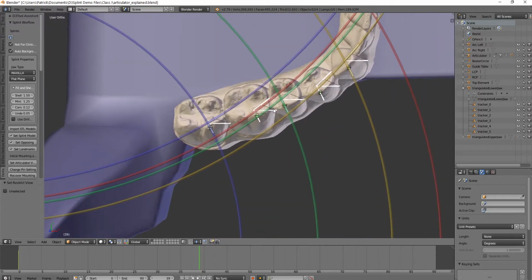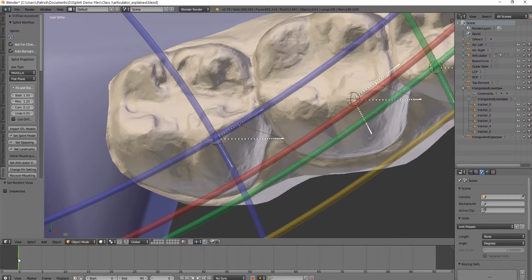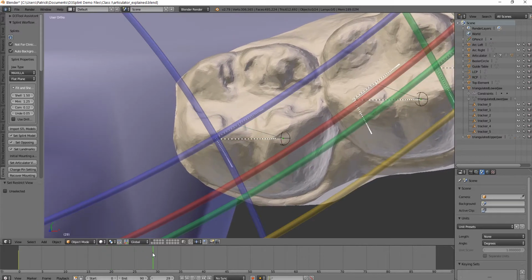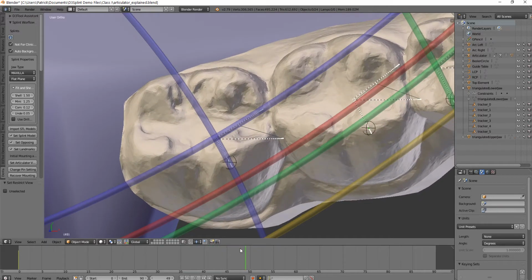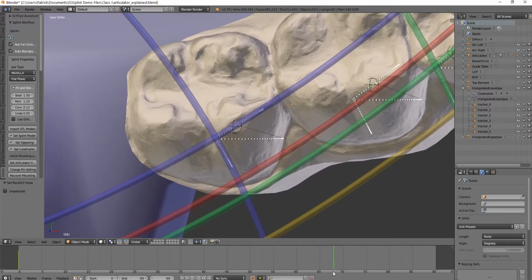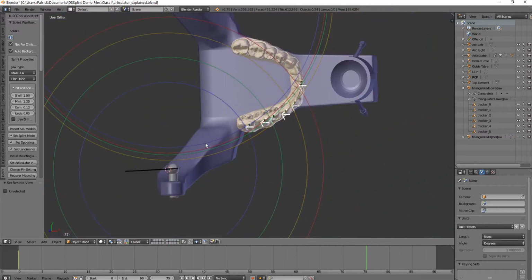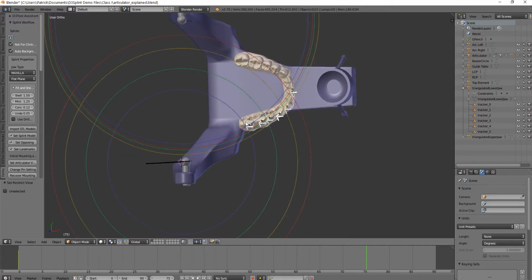If we zoom in on the second molar, we see the same thing. We get a straight forward protrusion, a much more lateral movement in the excursion that's on the same side, and then a more anterior movement for the contralateral excursion. So we get more protrusion on the right side in the left rotation movement because the arc is more aligned with, well, if you're watching this video, you probably already understand that.